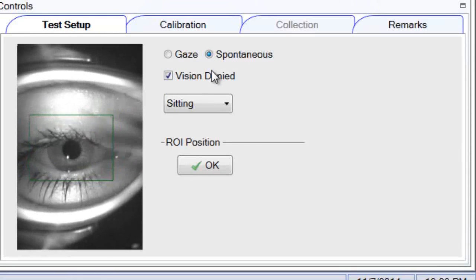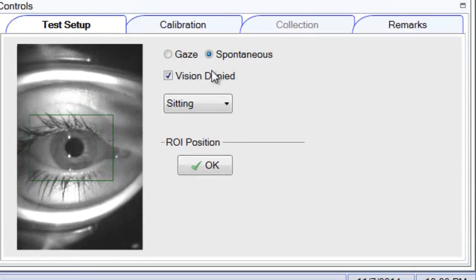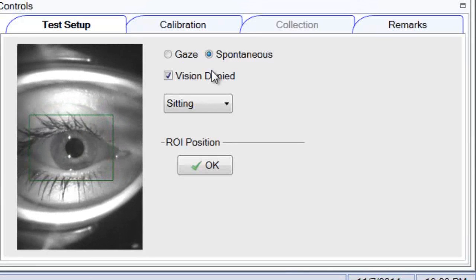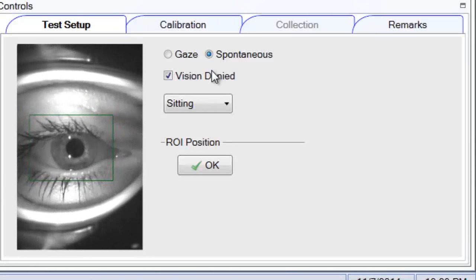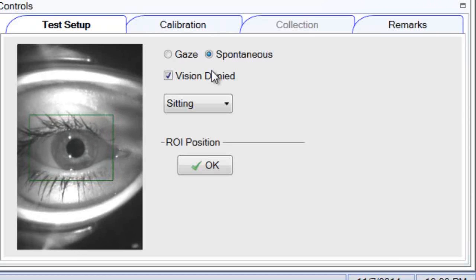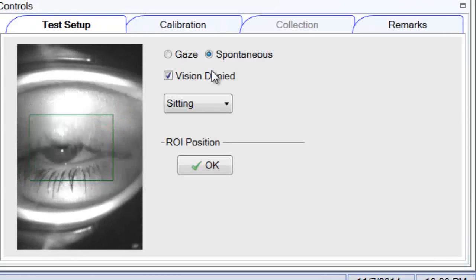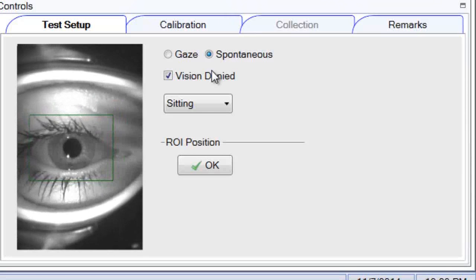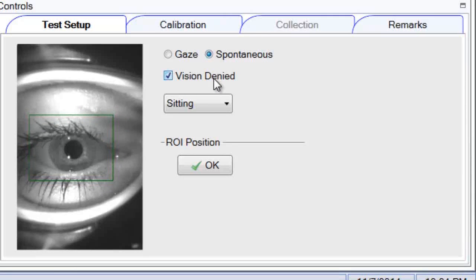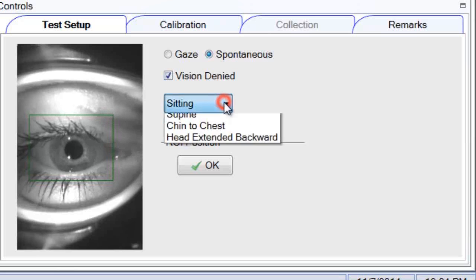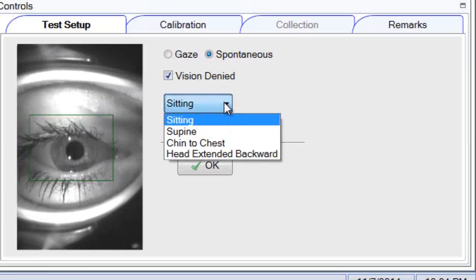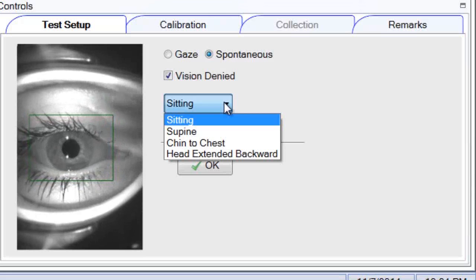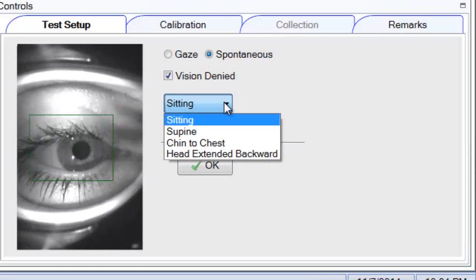Remember that you need to calibrate beforehand, and always calibrate without vision denied. So if spontaneous is the first test you do, uncheck that box, go through calibration, then put the vision denied solution on, and then run your spontaneous. Click spontaneous, choose vision denied, and then you have four options: is the patient sitting, supine, chin to chest, or head extended backward?